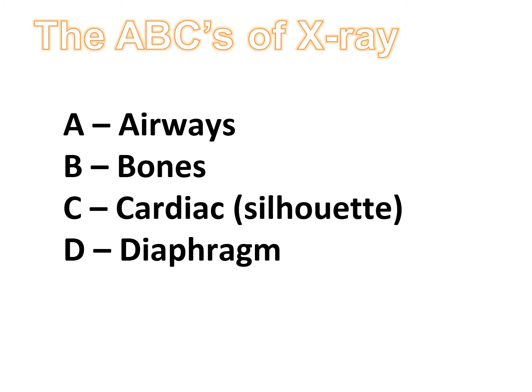There should be symmetry of the bones, meaning the clavicles, your collarbones, should look similar on each side. There should be a cardiac silhouette, which is like a shadow of the heart. The heart size should be less than 50% of the chest diameter on PA films, and we'll talk about that with some of the different examples coming up.